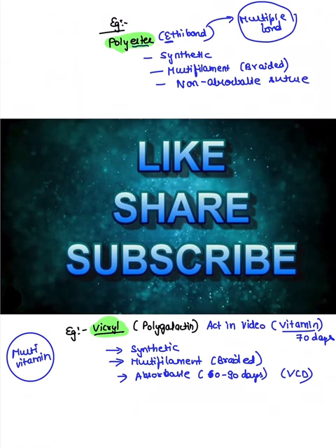Ethibond, multiple fibers making a bond, hence it is a multifilament. This comes under the mnemonic SLIP, hence it is a non-absorbable suture. It's synthetic. Vicryl, guys, that means it is a synthetic suture. Vicryl is again a multifilament suture and gets absorbed in 60 to 90 days. Mnemonic was multivitamin tablet. So guys, try to revise it once, and I'll send across the PDF on the group.